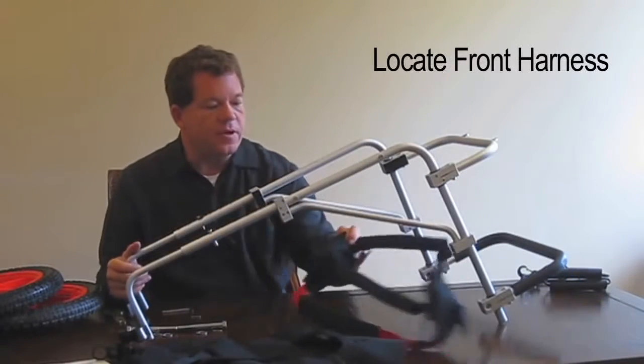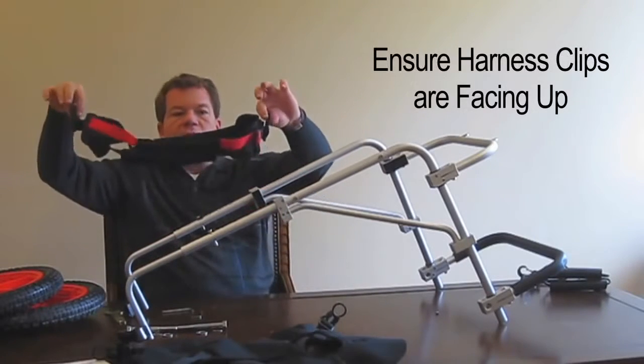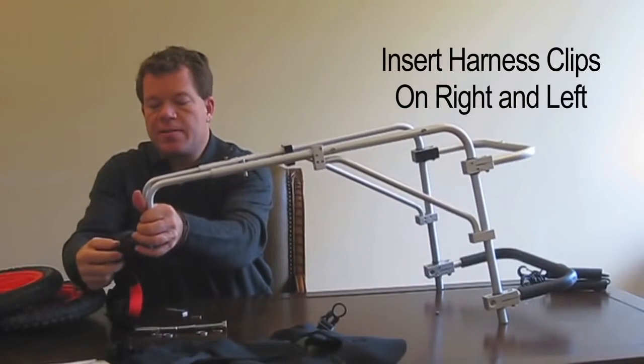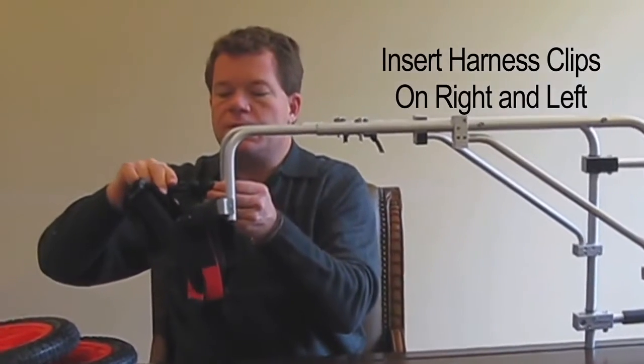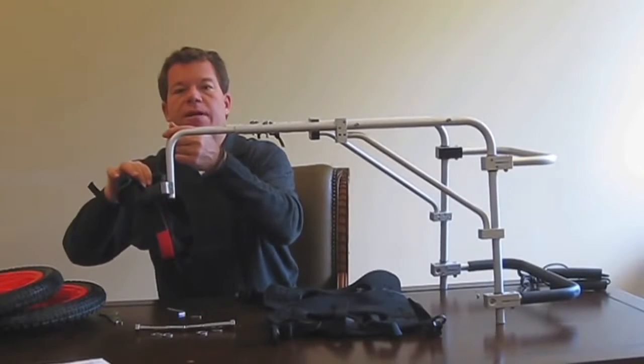Now we're ready for the front harness. On each side there's a clip that goes up. Simply clip it into the clip holder on the left side, then clip the right side clip in as well. Now that it's clipped in, the front harness is ready.